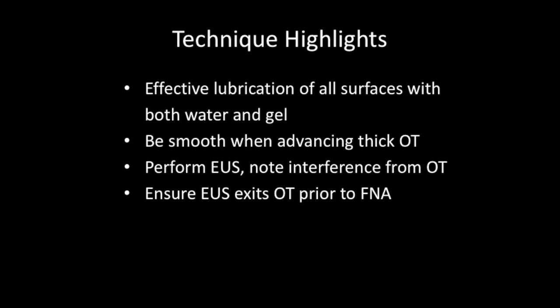As technical highlights, we recommend to lubricate all surfaces as much as possible with water and gel. Perform normal EUS, taking care not to provoke interferences from the overtube on the image, and withdraw the overtube when this appears. Finally, take care to be out of the overtube before performing FNA.